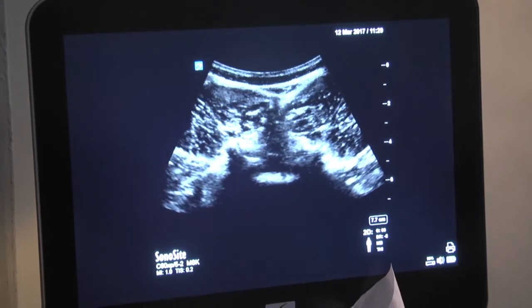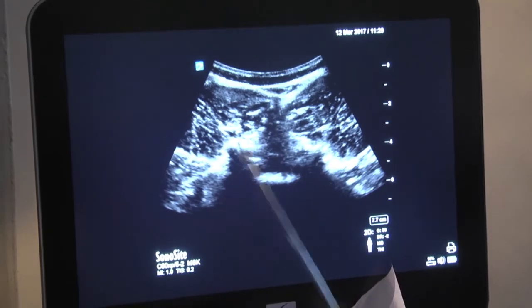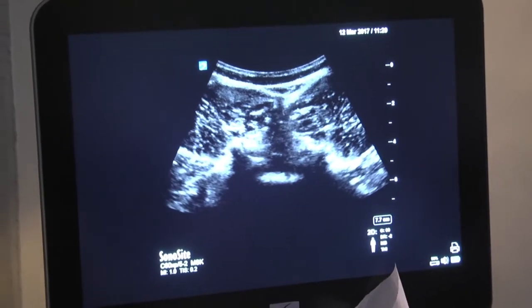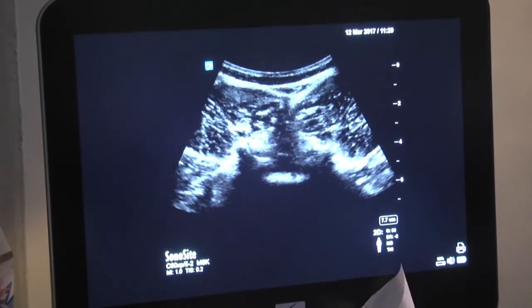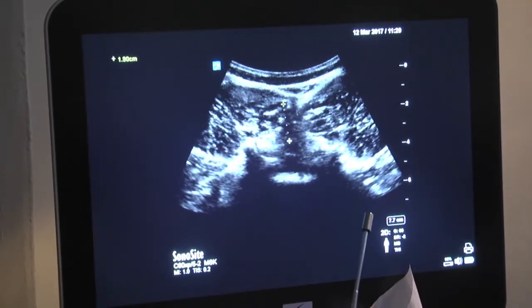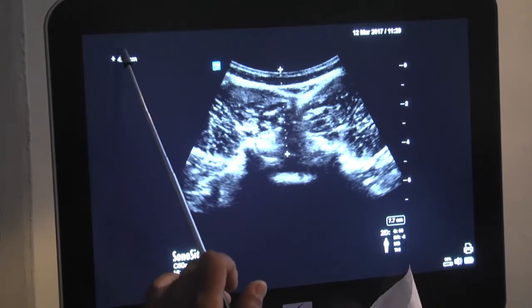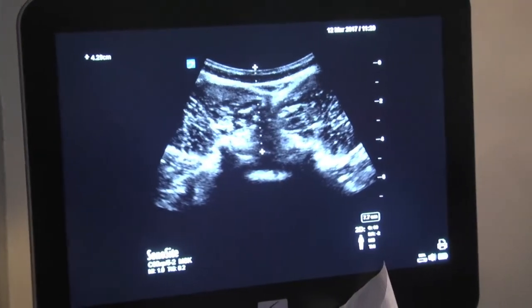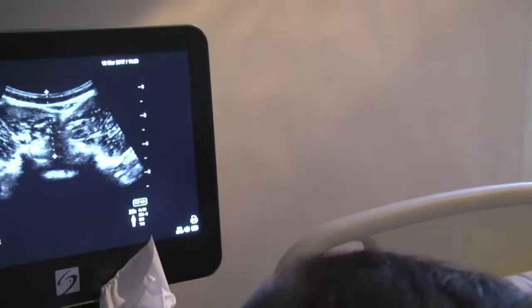Okay. So this can be useful if you're looking for symmetry of the vertebra, any rotational defect. In this case, it's quite symmetrical, so there is no scoliosis. It can be like your Mallampati of your spinal and epidural, if you may. You can also use it to measure some distances. A very simple tool, you can just use the caliper and measure the predicted depth to the dura. There's very good correlation between this and the eventual distance, but remember, it's not going to be 4.29, okay? There is some compression, so there will be some variation. So usually within a centimeter, you should reach the thecal sac, okay?